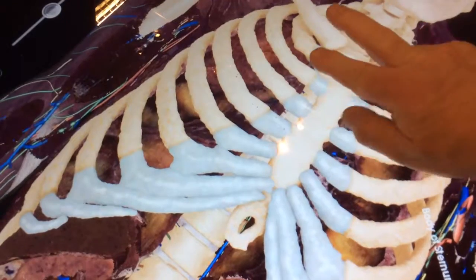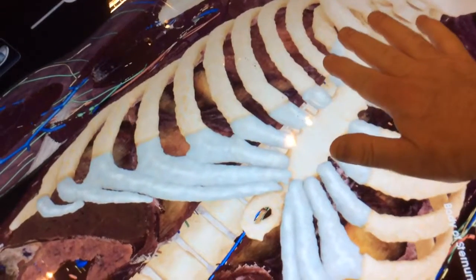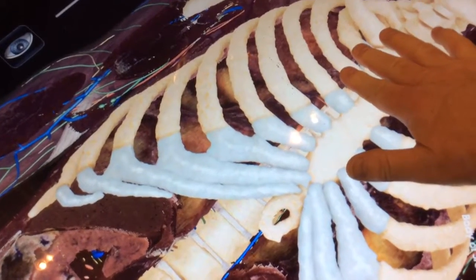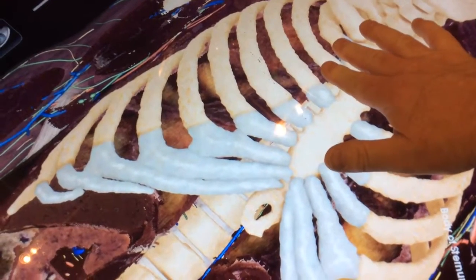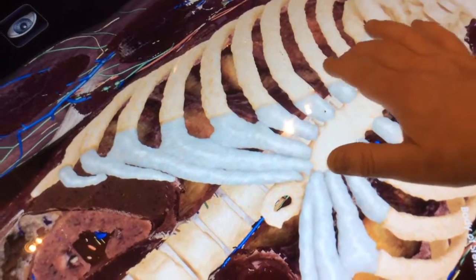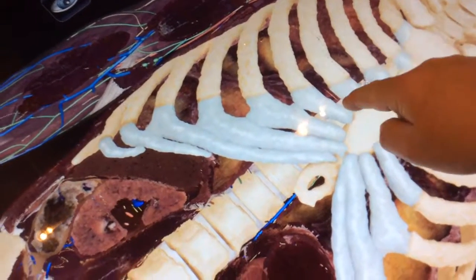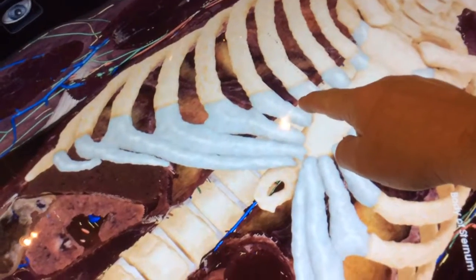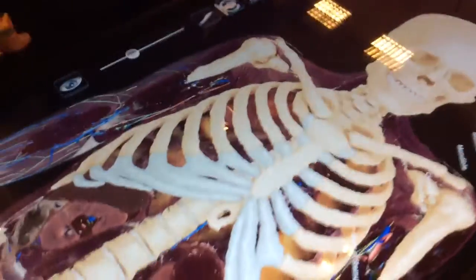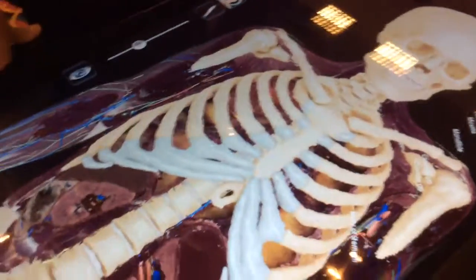So when you lay the palms of your two fingers down right next to the sternum, just below the clavicle, you're basically straddling the second rib, and you can feel that intercostal space right at the sternum. Then you go down to the third and then the fourth, and this is where V1 goes right here. Some people use the sternal notch and the angle of Louis. Complete, utter waste of time. So that's nice. Okay, thank you.